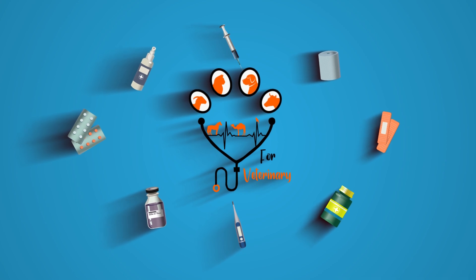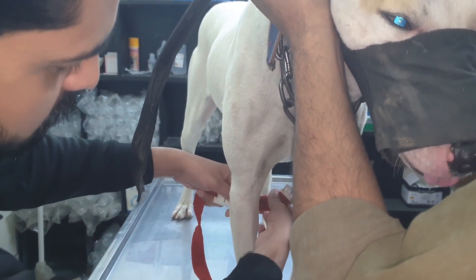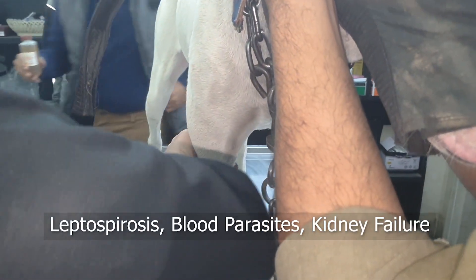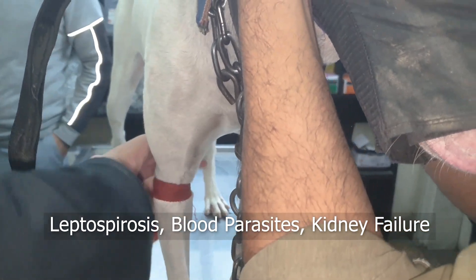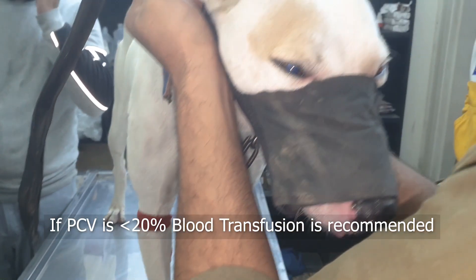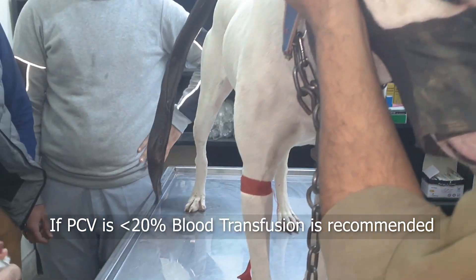Hello and welcome to my YouTube channel. Today we are going to see blood transfusion in dogs. There are certain conditions or diseases in which a dog may need blood — for example, leptospirosis, blood parasites, or kidney failure — in which the packed cell volume of a dog drops below 20 percent, and then the dog may need blood.